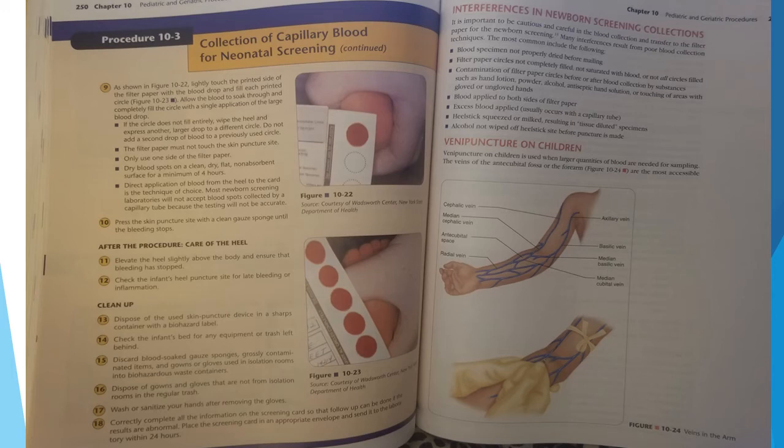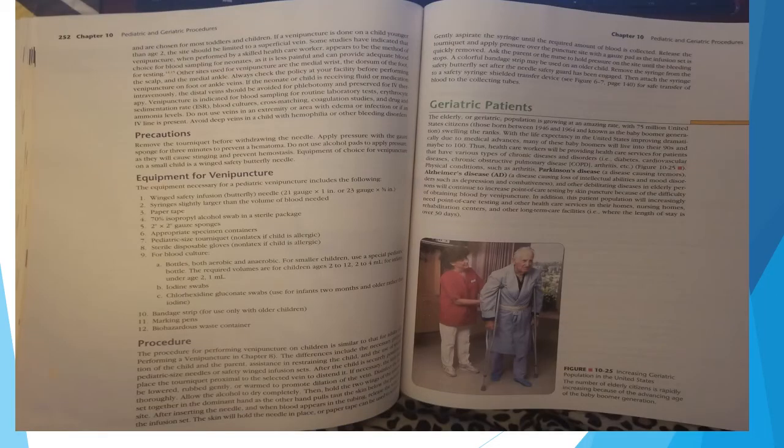Venipuncture on children. Venipuncture on children is used when large quantities of blood are needed for sampling. The veins of the antecubital fossa or forearm are the most accessible and are chosen for most toddlers and children. If a venipuncture is done on a child younger than age 2, the site should be limited to a superficial vein. Some studies have indicated that venipuncture, when performed by a skilled healthcare worker, appears to be the method of choice for blood sampling for neonates, as it is less painful and can provide adequate blood testing.